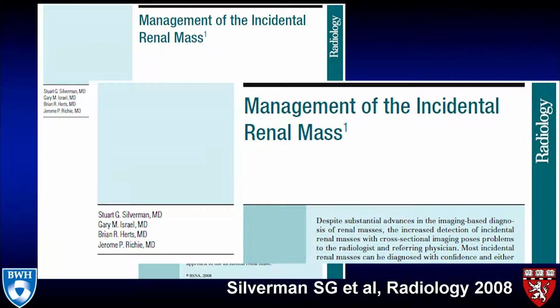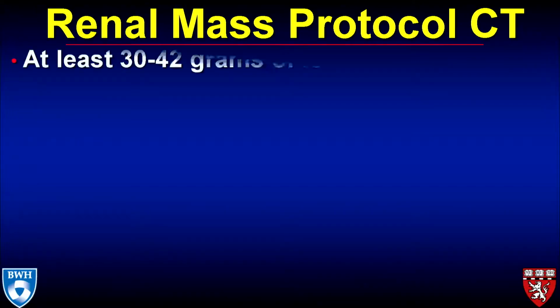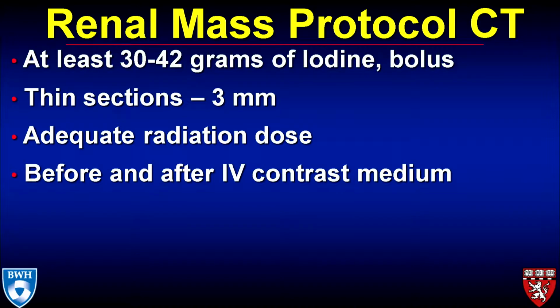So if we go back 10 years ago now, in this particular paper we were espousing that you needed to fully evaluate renal masses and do a full, what's called renal mass protocol CT. And all this is in your handout. So some of these slides I'm going to go through very quickly to try to save more time for some of the more complex slides.